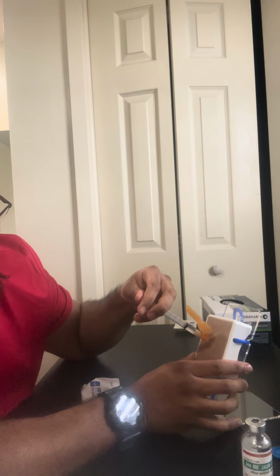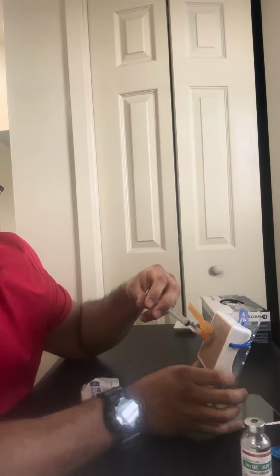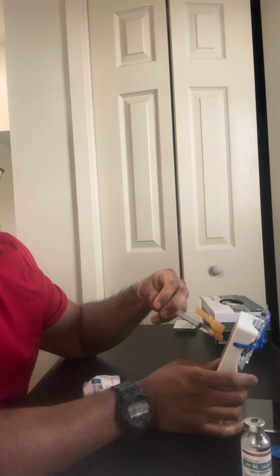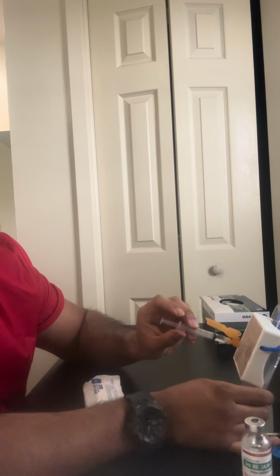It's going to be 10 seconds per mL, if I'm not mistaken. Once you administer your medication, you come straight out.